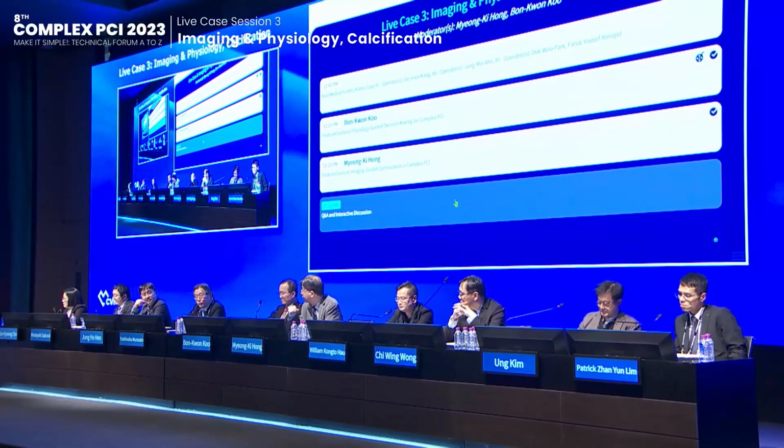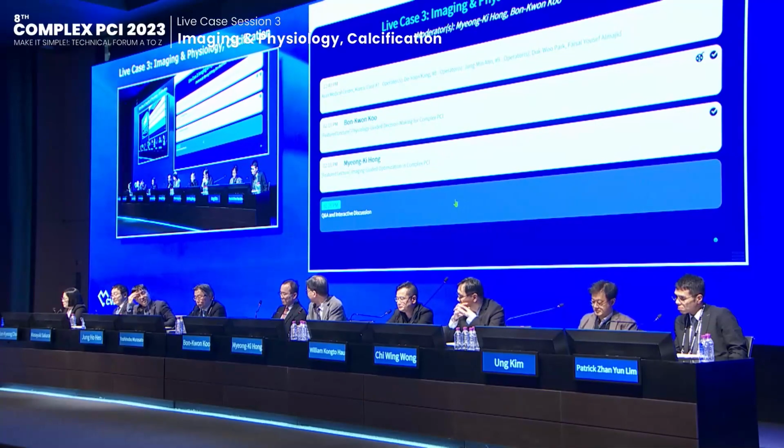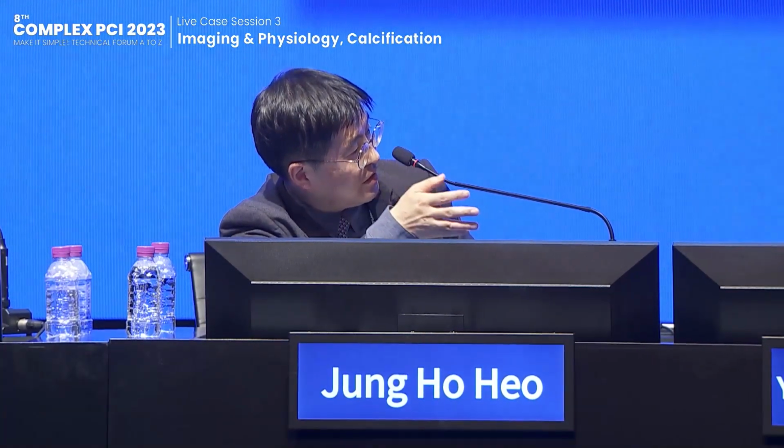Any more comments? Also, I have a question for Professor Hong. After the OCTOBER data presentation, is there any change? What's your opinion about OCT and IVUS in clinical practice?